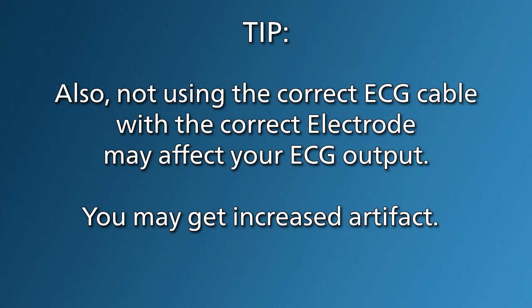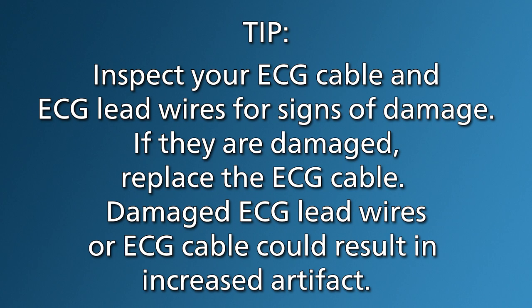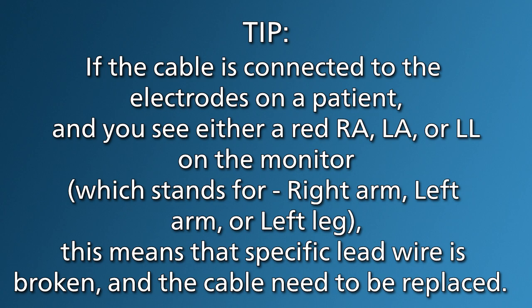Tip: inspect your ECG cable and ECG lead wires for signs of damage. If they are damaged, replace the ECG cable. Damaged ECG lead wires or ECG cable could result in increased artifact. If the cable is connected to the electrodes on a patient and you see either a red RA, LA, or LL on the monitor, which stands for right arm, left arm, or left leg, this means that specific lead wire is broken, and the cable needs to be replaced.